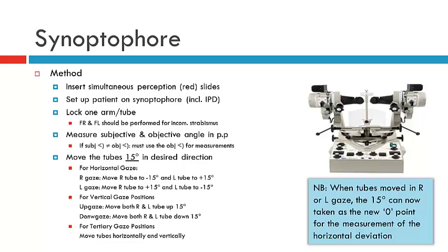Last semester we learned how to assess the patient in primary position, but we can actually move the synoptophore into nine positions of gaze by moving the tubes into various positions. Generally we'll move them 15 degrees from the primary position — for example, 15 degrees into right gaze and then 15 degrees up or down to represent dextral elevation and dextral depression.